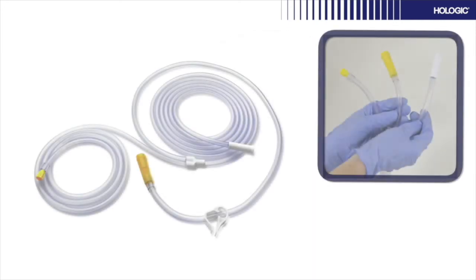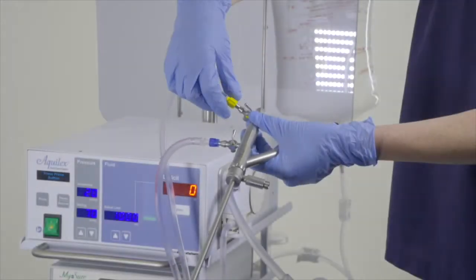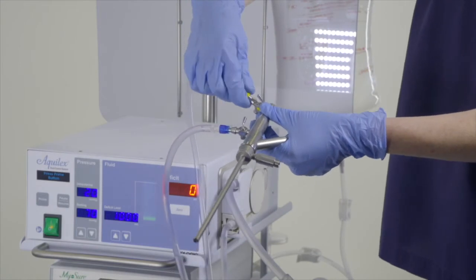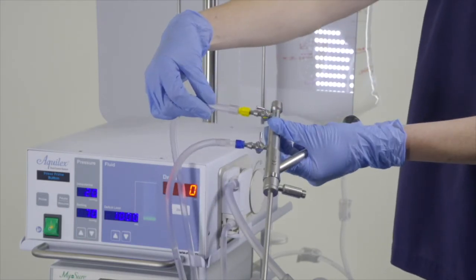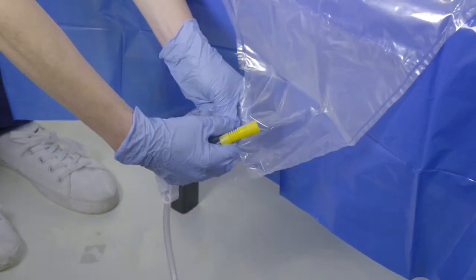The outflow tubing is in the shape of a Y with three openings. Yellow luer lock for the outflow channel on the scope, yellow tip for the underbuttock drape, and white tip for the front right canister. Attach the yellow luer lock to the outflow channel of the hysteroscope, and attach the yellow tip to the underbuttock drape.